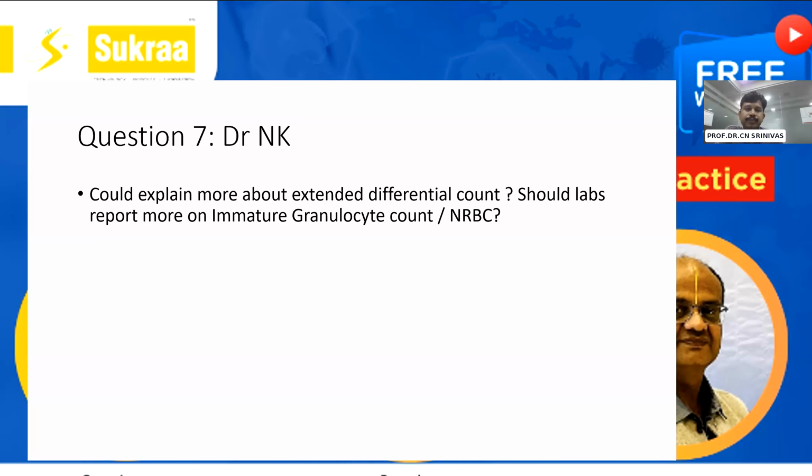Yeah, what you said is right. The immature granulocyte count is an earliest marker for sepsis, and it might indicate the infection itself. Now, do you feel that we still have the habit of asking for a shift to the left, or is the immature granulocyte count the same as the shift to the left, doctor? Just a question, because most of us get this from the clinicians itself. That's why I'm asking you. What is your thinking? Is it more or less synonymous, or is it different?